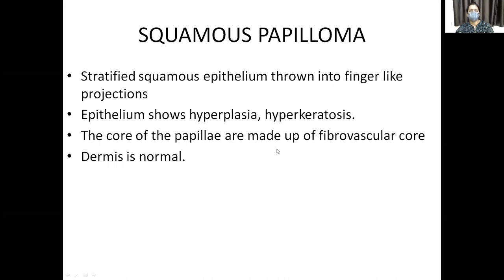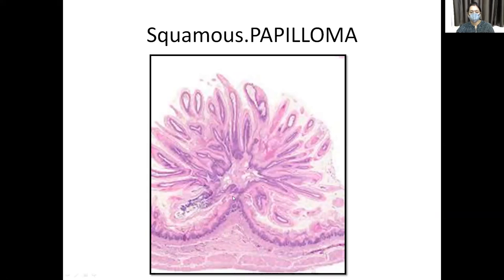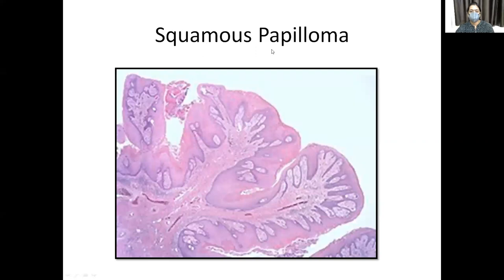Now, the benign proliferation of squamous epithelium into finger-like projections forms squamous papilloma. What we see is: finger-like projections, the epithelium shows hyperplasia (increased number of cells), hyperkeratosis, and the core of the papilla is made up of fibrovascular tissue, while the dermis remains normal. Here in the low-power picture we see the normal squamous epithelium suddenly overgrown into finger-like projections.